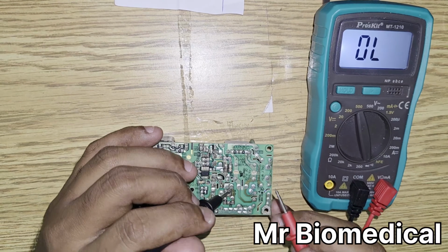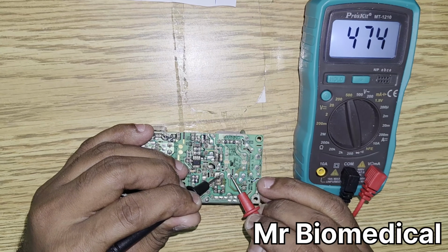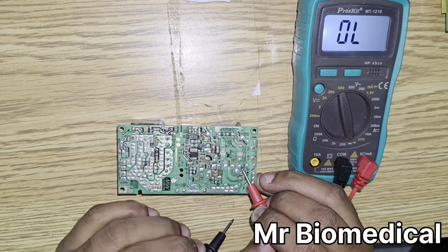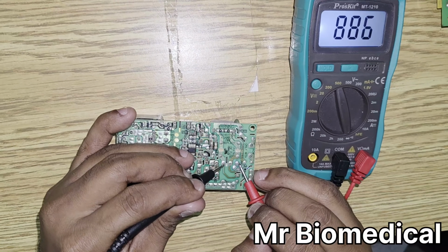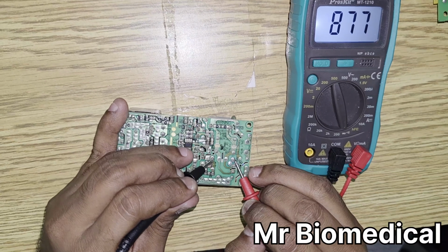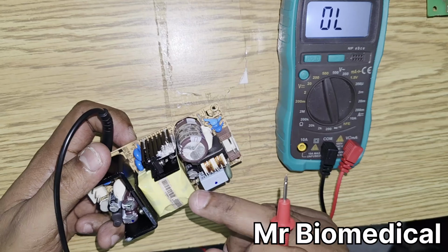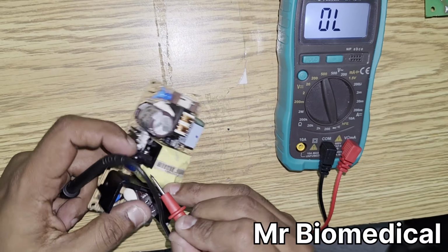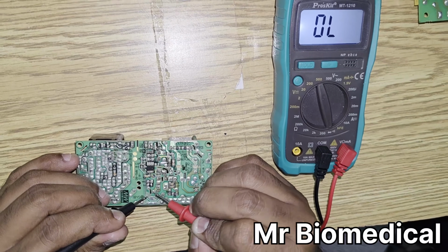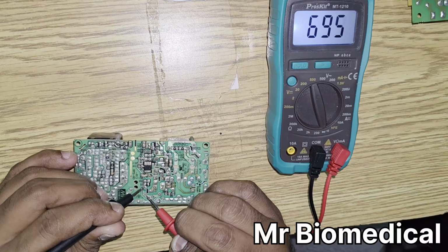First step in the bridge rectifier, we have to check with the negative here and positive here. You have to get this kind of values, 450 above and 550 below. Same like this, I have to take measurements, and there is no short or anything. The bridge rectifier is good. So what might be the issue? Next we have to go to the switching transistor over here and check for a short or something. That's good.